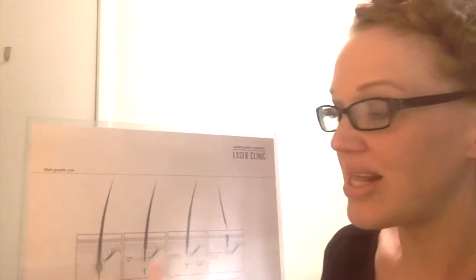Every time a client comes in for a treatment, they'll have all of the hairs in that treatment area treated with the laser. All of the hairs will respond at the time, and over the next couple of weeks all of the hairs that were present when they came in for treatment will fall out.